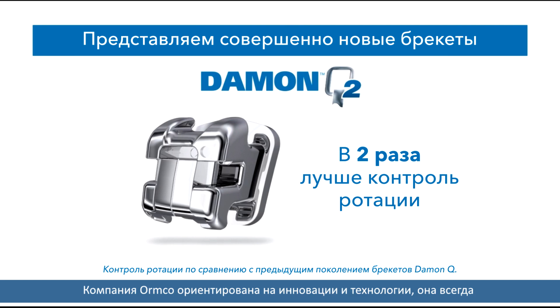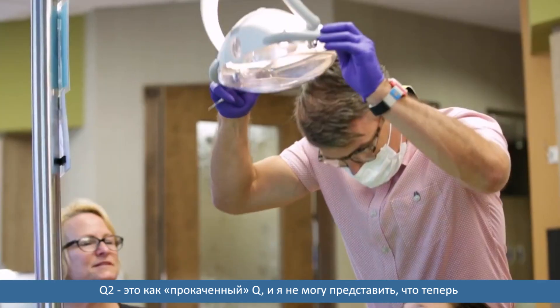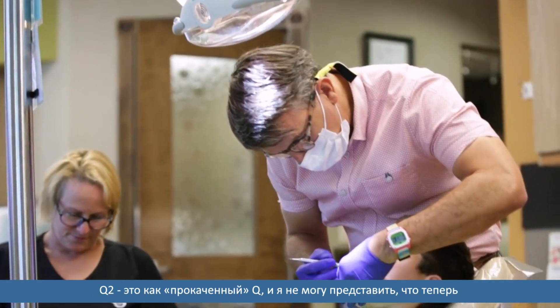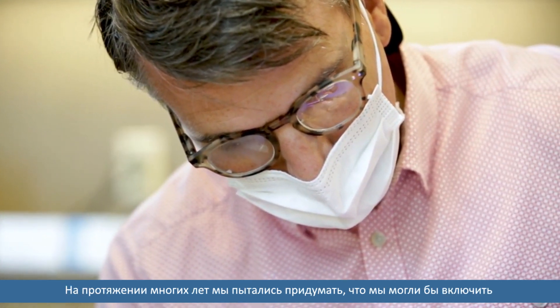Ormco's commitment to innovation and technology — they're always one step ahead in creating something amazing, and that's what we have in the Q2 bracket. It's like the Q2 is just on Q steroids, and I can't imagine practicing right now without the Q2 bracket in my hands.